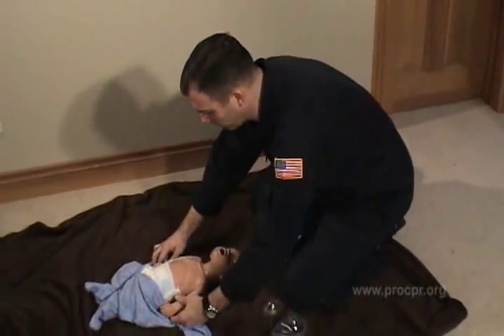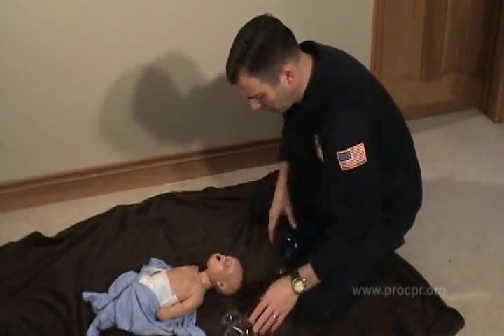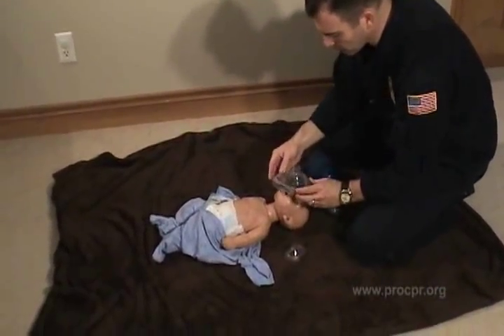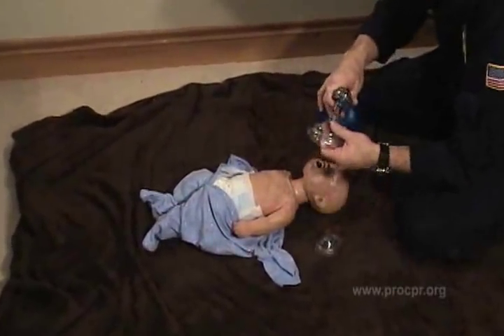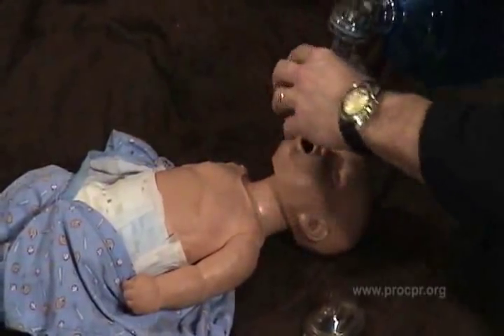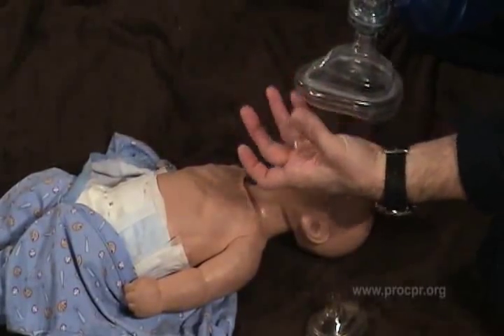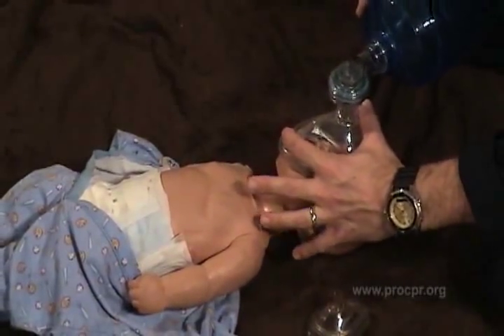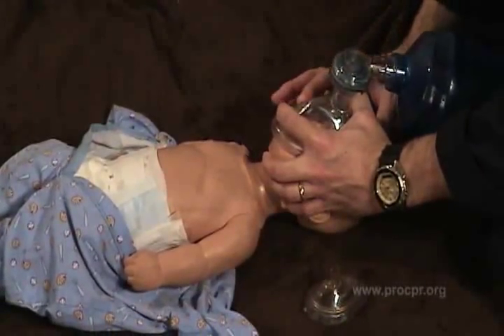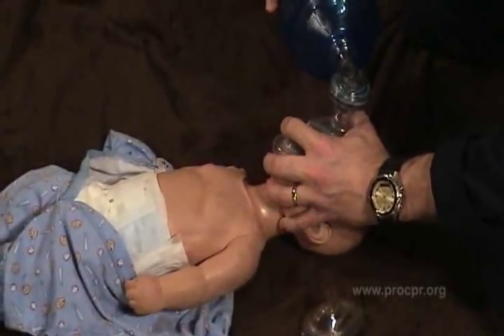Now, concerning the infant, we're going to look at how to use both size face masks when using the bag valve mask ventilation technique. If a rescuer only has an adult size face mask, we can't use it the way we would for an adult. So we're going to flip it around upside down so that the smaller, more narrow end, the apex of the mask, seals around the chin and bottom lip of the baby, while the upper, wider part of the mask covers the forehead, eyes, and face of the baby.